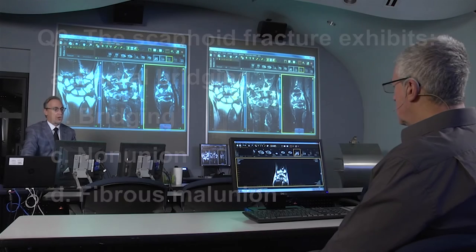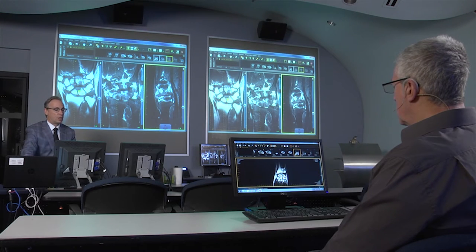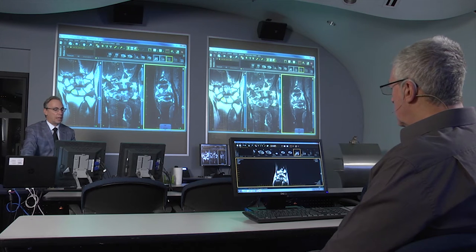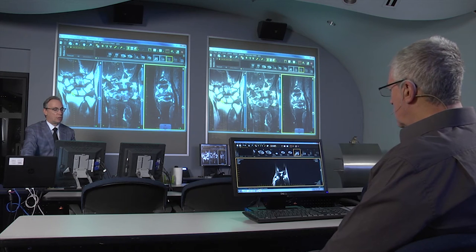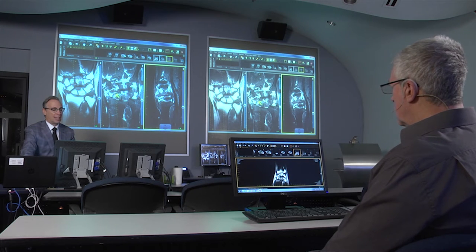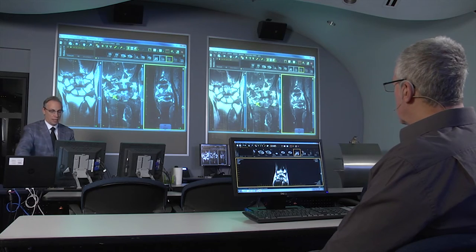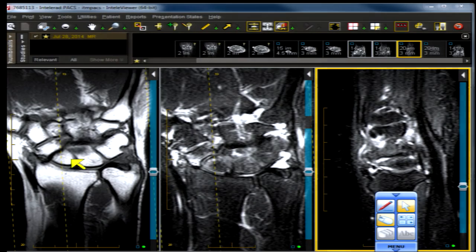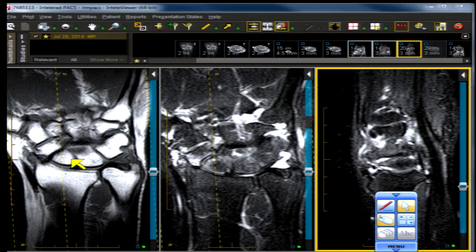The coronal projection T1 fat-emphasized shows a scaphoid with a large cleavage plane through it — it's through and through, the cortex is interrupted. The water-weighted T2 fat-suppressed image demonstrates high signal intensity in the scaphoid. Let's do a little drawing here to demonstrate the proper way to image a scaphoid, which in earnest was not done here optimally.